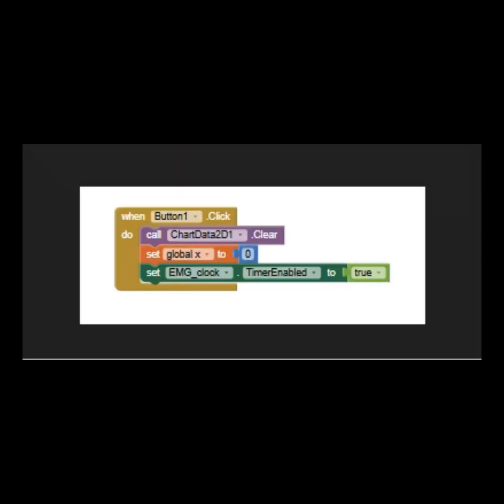And this is to connect the second ESP32. We want to register for strings. And this right here will make our graph using the bytes we get from the string. And this last part is just to generate a new graph.